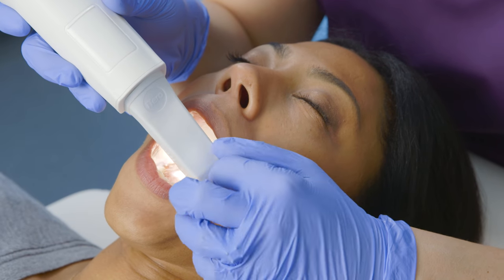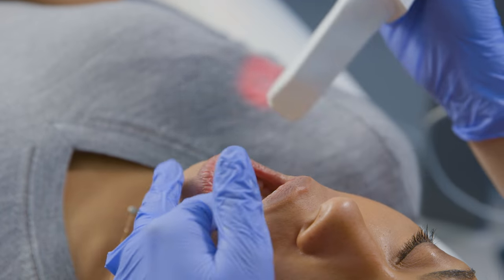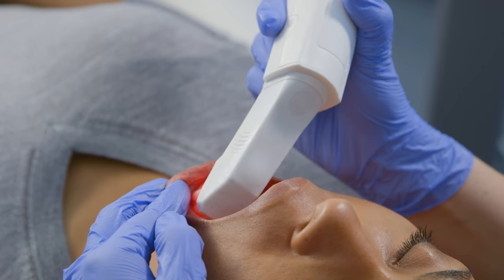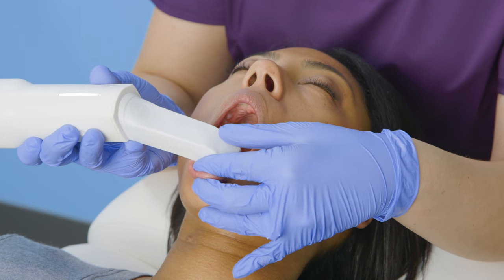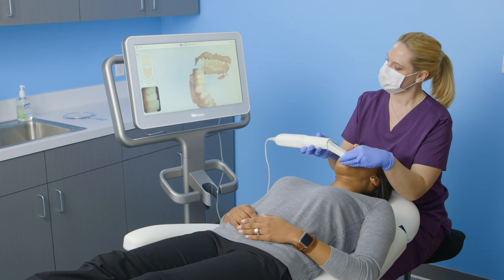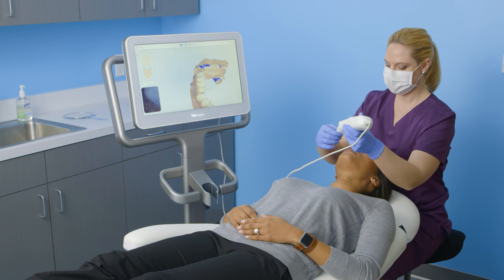I use the wand tip to help retract the cheek, lips, and tongue. I use the fingers of my opposite hand for retraction and to guide the tip during scanning. While I'm scanning the buccal, I often switch hands when I reach the contralateral side.